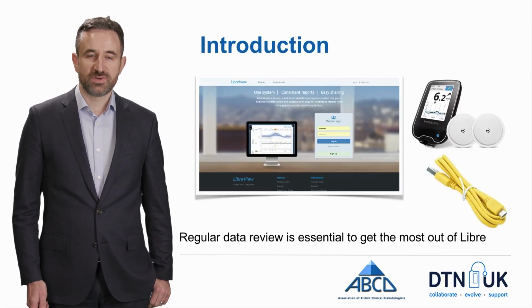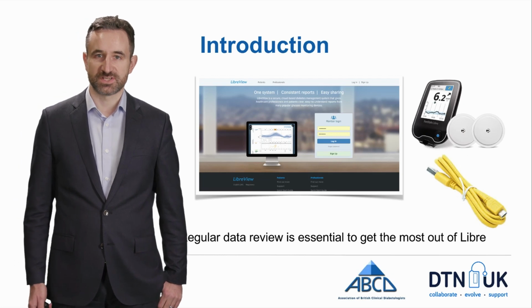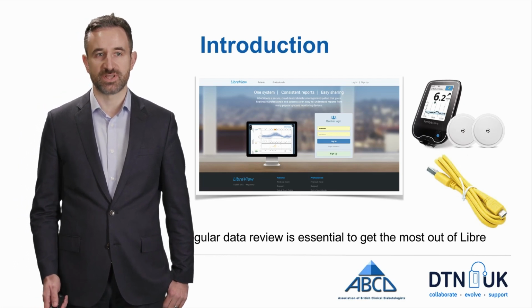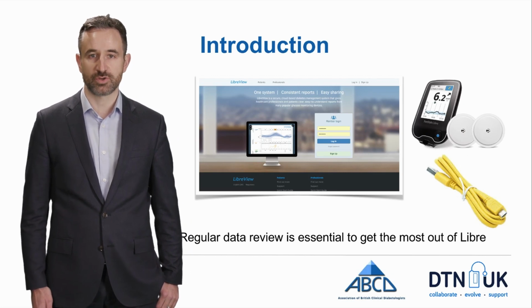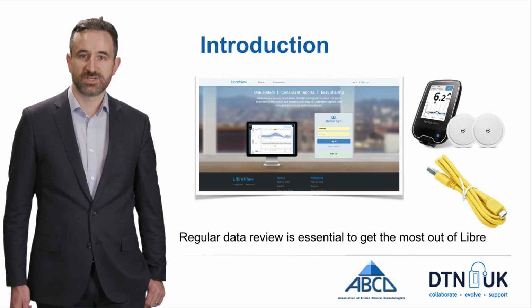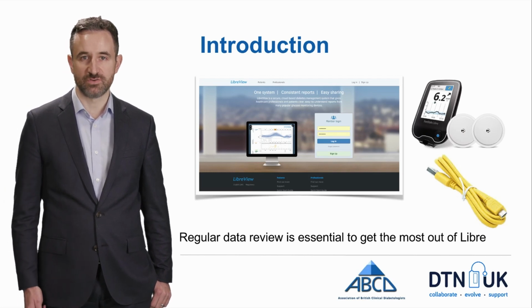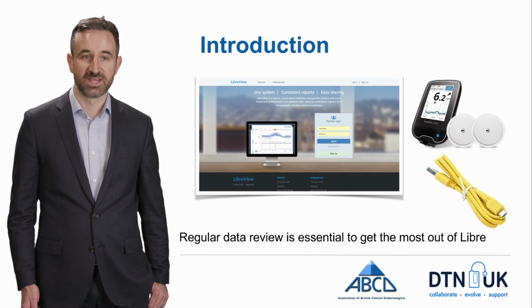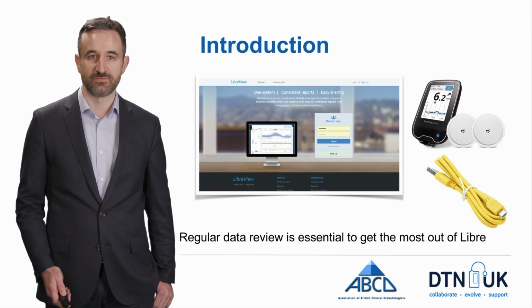So the key thing with the Freestyle Libre is that regular data review is really essential to get the most out of the system, and the best way to do that is with a system called LibreView, which is available at libreview.com. When you start using a Freestyle Libre, you initially will have at least 10 times more data to review than you would have done with finger prick testing, and using this system really does help get to grips with that additional information.